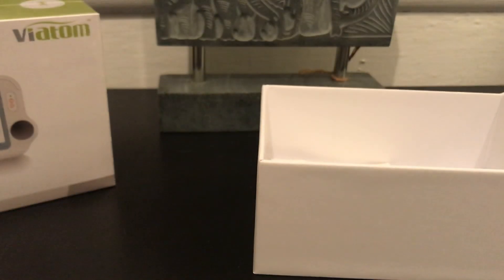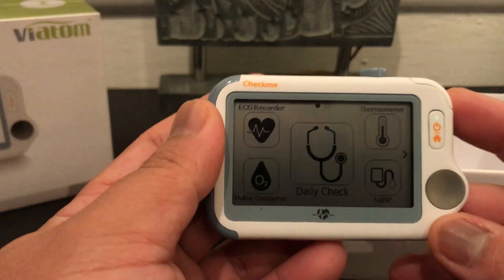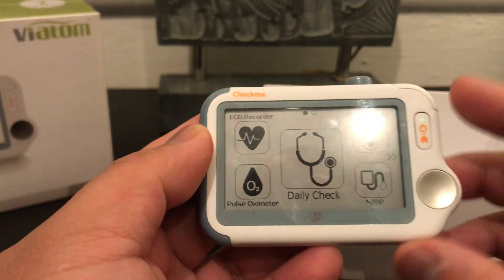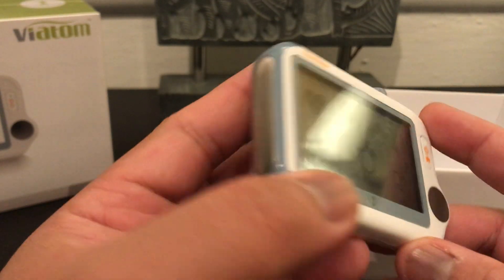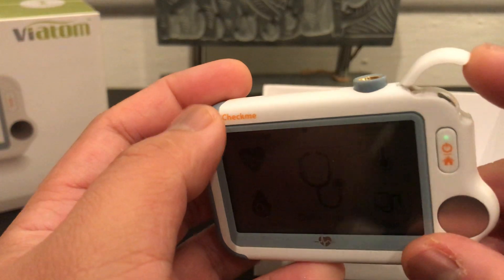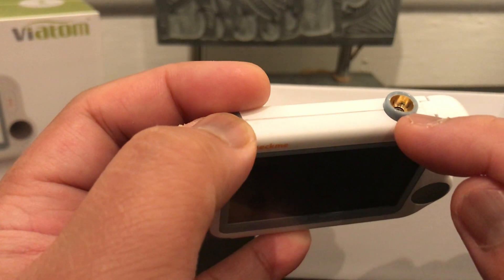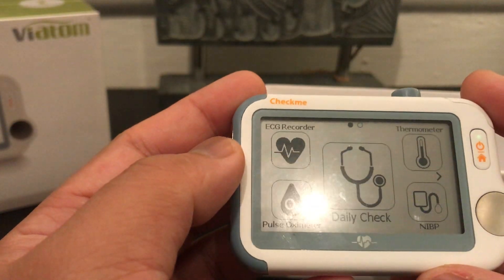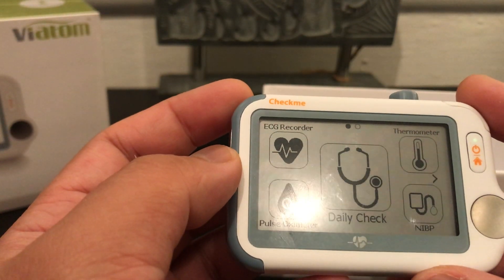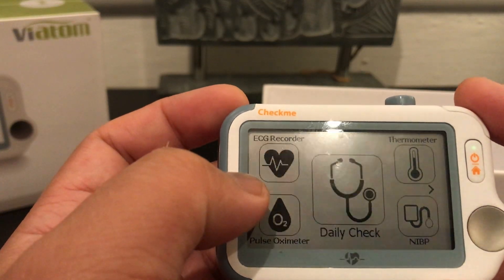Let's look at the device. You can see it has a very big touchscreen. It has built-in sensors — one here, one here, and one at the back. This is the sensor for the oxygen level, and this is the sensor for the forehead temperature.